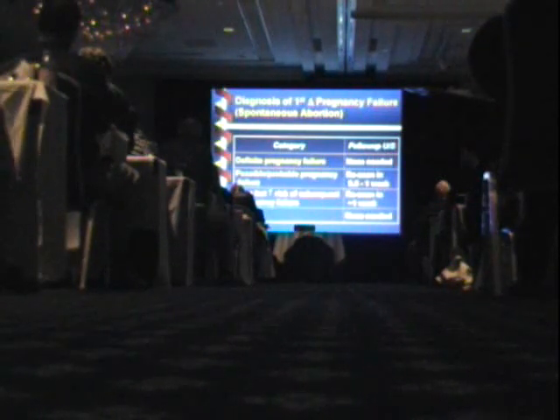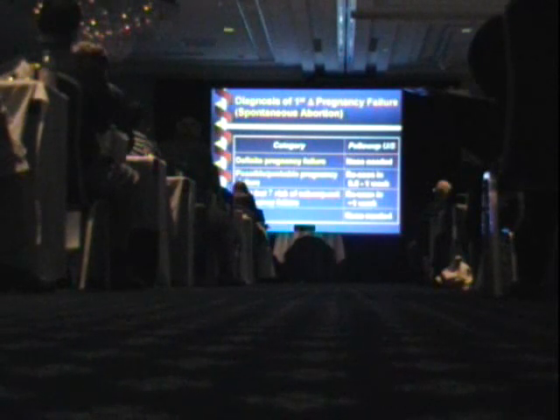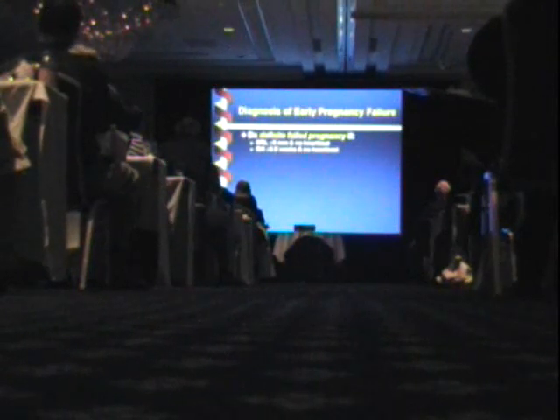And the final category is normal, in which case, of course, you congratulate the parents on their normal early pregnancy and no follow-up is needed. So how do we put these rules into play? How do we get these categories?